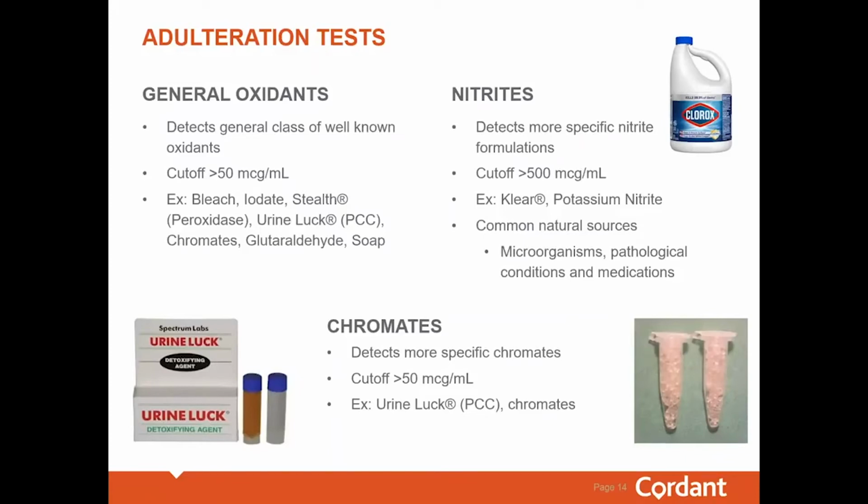What is important to note is there are some rare scenarios where a sample may have elevated nitrite levels naturally. This could be from certain pathological conditions, certain medications, microorganisms, and sometimes in the presence of blood in the sample. So be sure to take a closer look at individuals with elevated nitrites before taking adverse action.